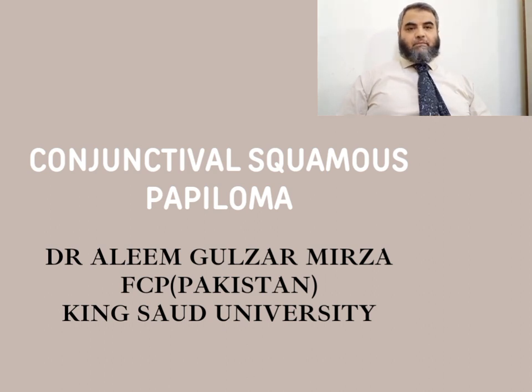Today, my topic of discussion is a case of conjunctival squamous papilloma, its diagnosis by non-invasive methodology, and its management.